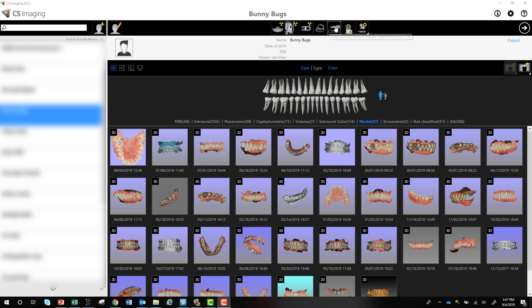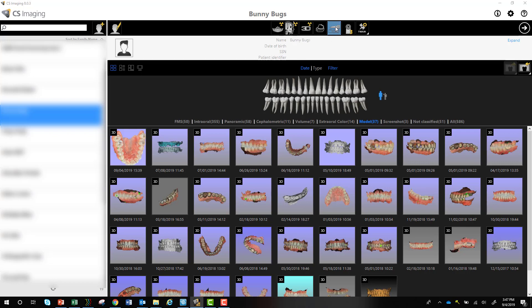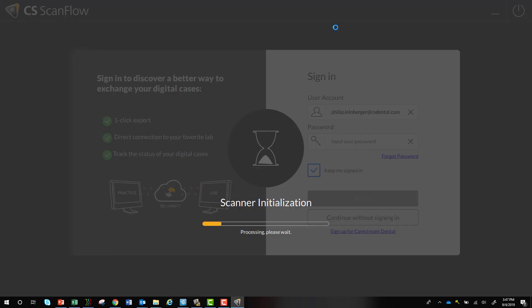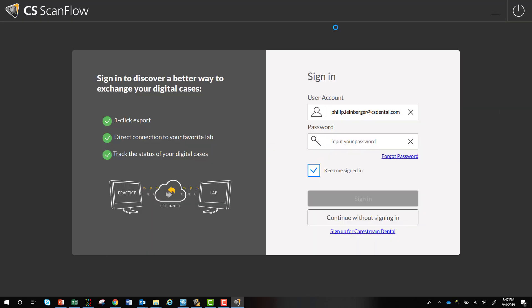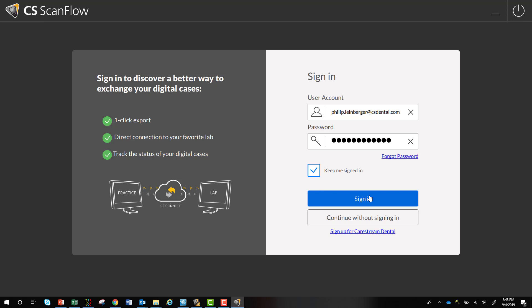First, you're going to select the scanner icon just like normal, and the first screen you'll see is your login screen. With your existing versions, every single scan you want to send to CS Connect asks you for your credentials each time. Here, you can log in once and stay logged in for a full week.